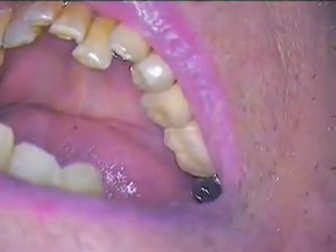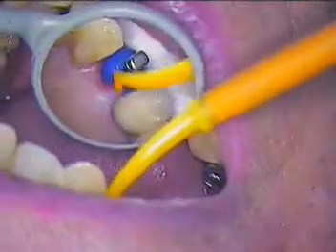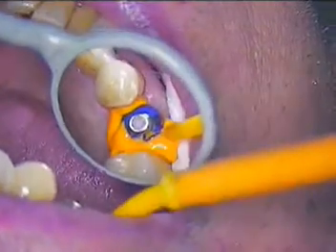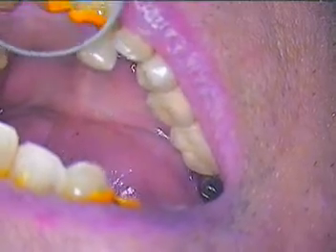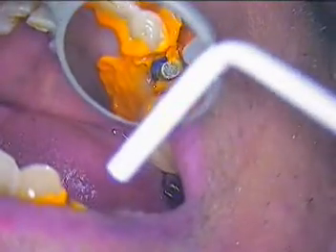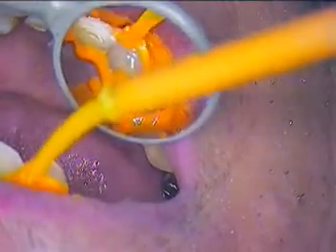We're going to go ahead. I'll go ahead and start injecting. And then we'll blow air — sometimes I can blow out some of that moisture. Come right back in and re-inject. And this is all live, there's no pre-recording here at all. So what you see is what you got.